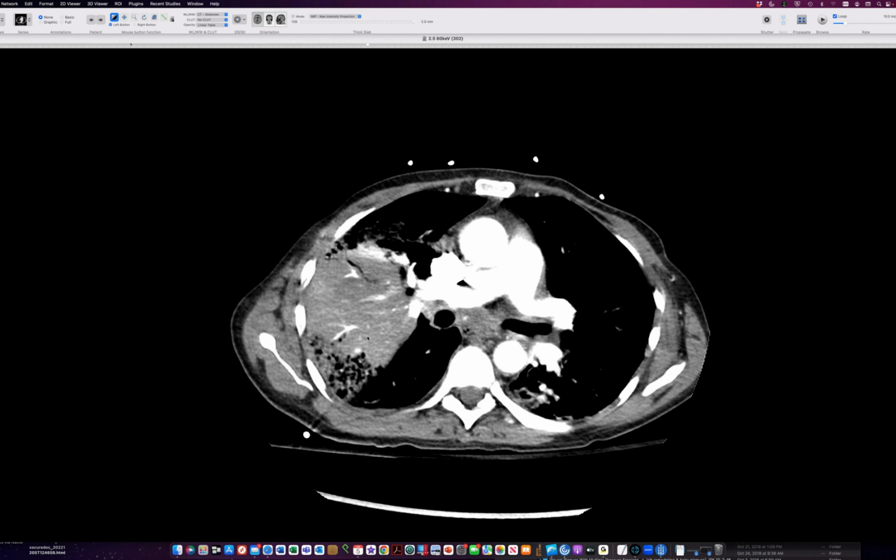people are worried most of all that they're seeing a viral pneumonia. When it's diffuse and it's sort of atypical and spread all over the place, ground glassy mostly, not dense and compact like this, then I think people are thinking that it's a virus, and viruses tend not to be that productive, at least early on in cough. But let me check with our ID people.